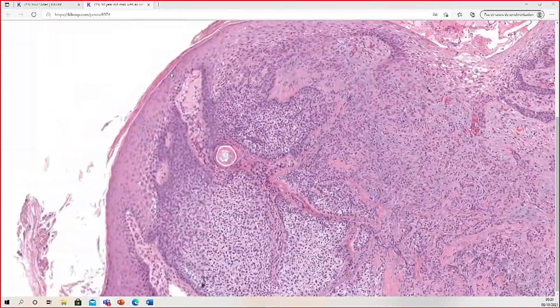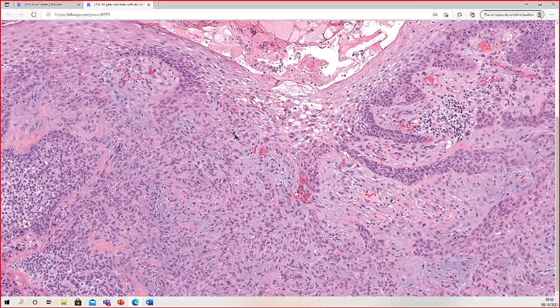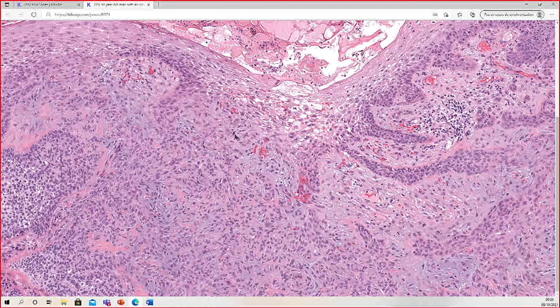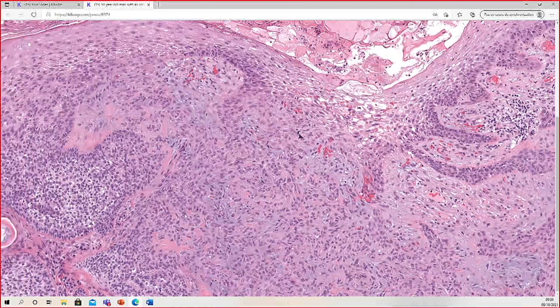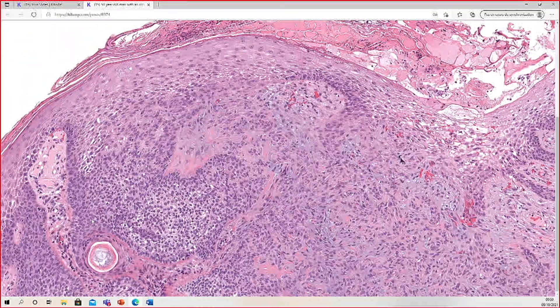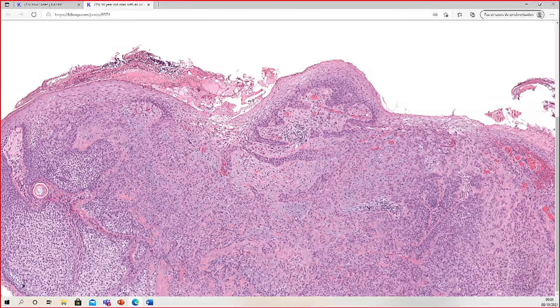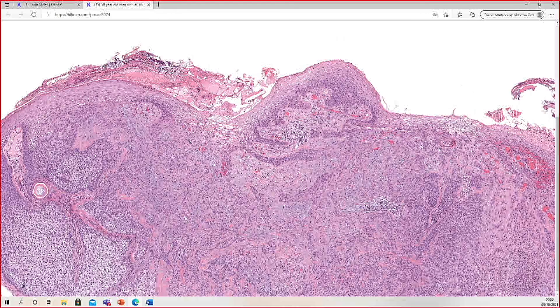If I have a small biopsy where I just see a tiny bit that looks a little like a trichilemmoma but I'm not sure, in my report I'll say 'basaloid neoplasm' and note that this could be a desmoplastic trichilemmoma or possibly basal cell or squamous cell — I cannot see enough of the lesion. Then the clinician can decide whether to excise more or watch the patient. If I see enough of the lesion at the edge, I feel comfortable saying trichilemmoma. If it is transected broadly, I add a comment that I think this is benign, but if it grows back they should excise or biopsy it again.